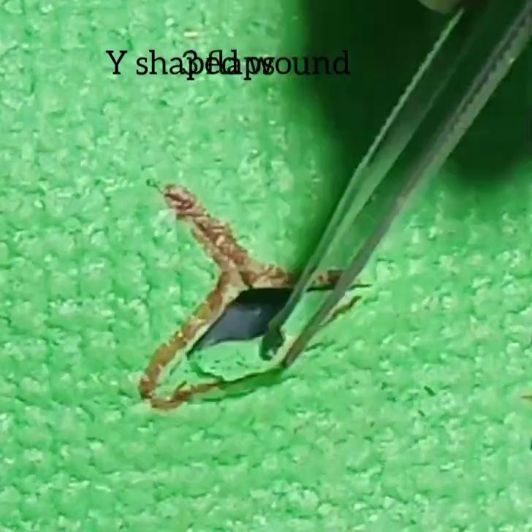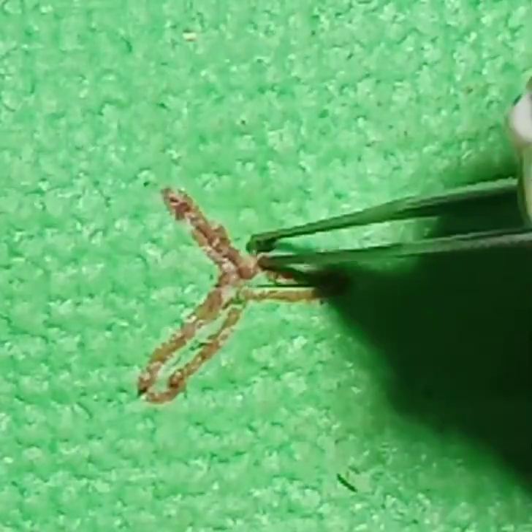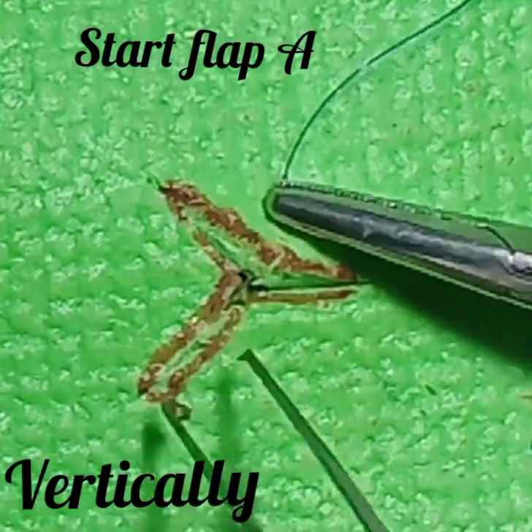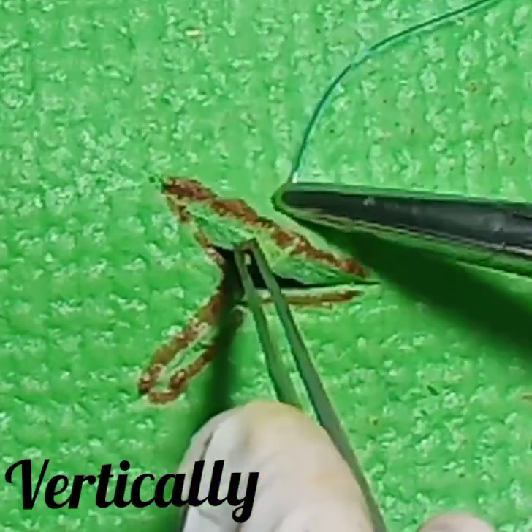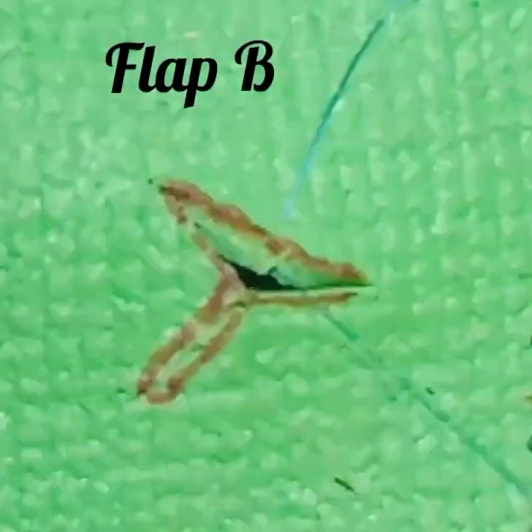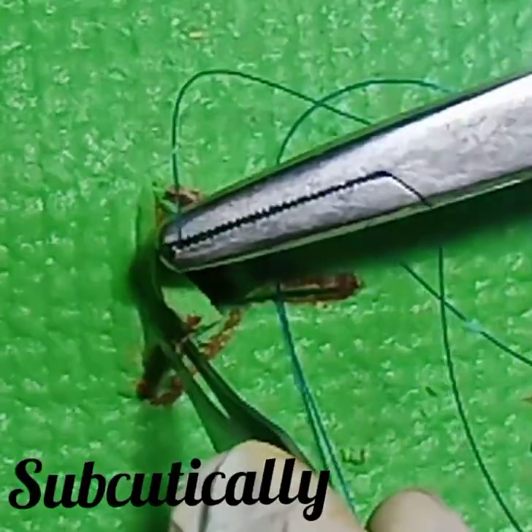This technique is for Y-shaped or V-shaped lacerations which have three flaps. Start from the first flap, going vertically from outside to inside. Then from the second flap, go subcuticularly.